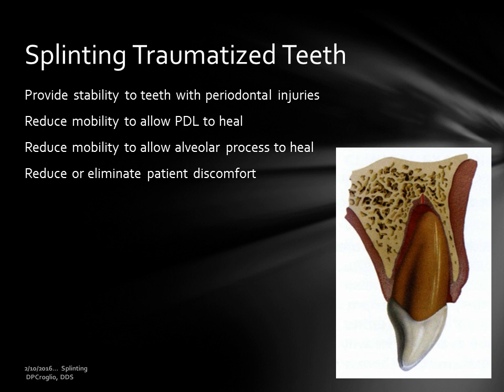The illustration at the right is from the Dental Trauma Guide, a collaboration between the International Association of Dental Traumatology and Copenhagen University Hospital, and I have received permission for its use. It depicts an extrusion injury where the tooth is displaced downward out of the socket. Rather than a comprehensive look at treating these types of injuries, today we will focus on the techniques used in applying a splint to the teeth that have sustained this injury.